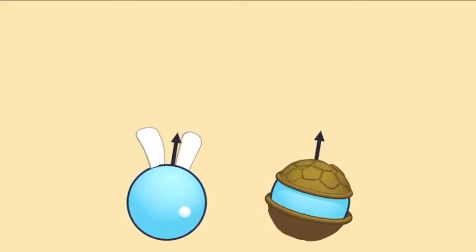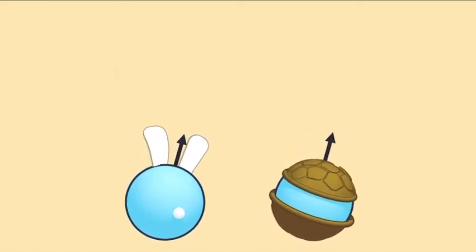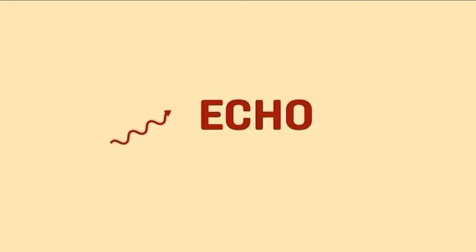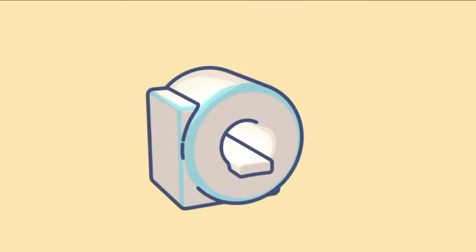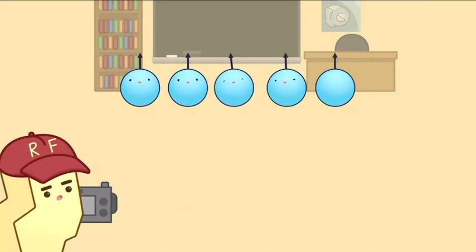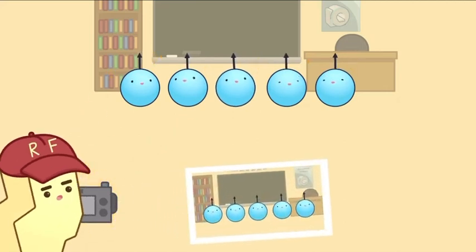When the proton precession syncs up following the 180-degree pulse, more energy is released back into the system. This is called an echo, and it is the information collected by the MR scanner which will eventually generate a medical image. We can liken the 180-degree refocusing pulse and the synchronous precession it creates to an elementary school class photo shoot. The teacher may need to raise her voice in order to get the class to focus its attention on the photographer and achieve a yearbook-worthy shot, the echo.